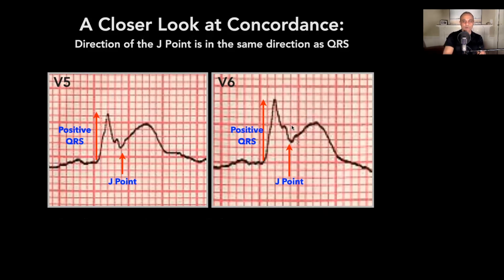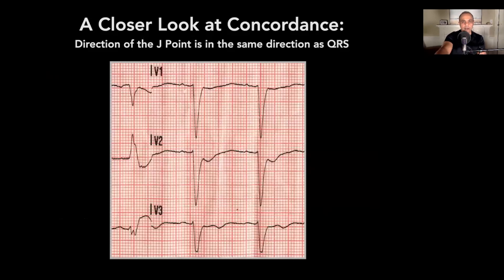Now look at V1, V2, and V3. In V2 and V3 especially, the QRS goes downwards and the J point follows the same path, also going downwards. That's another example of concordance.